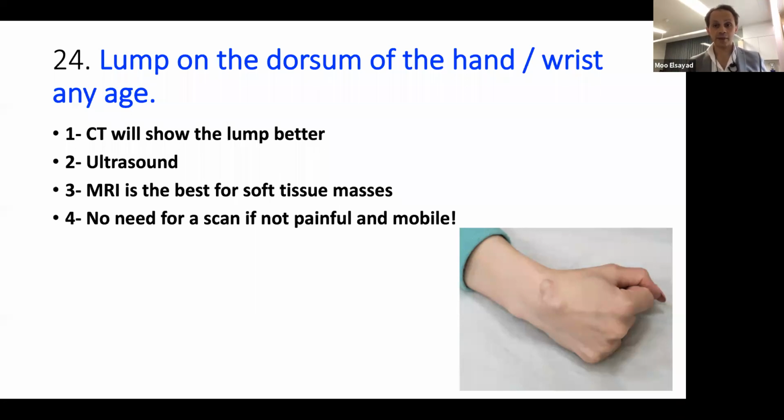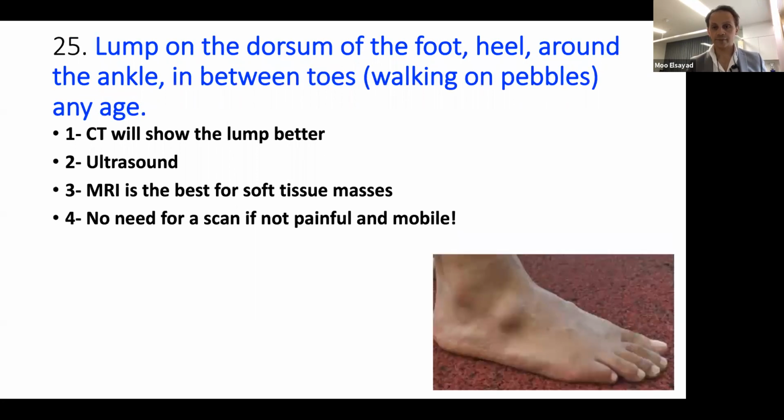So you may be helping the patient to say, ultrasound plus or minus aspiration. We do it at the same time, book him for the right slot or book her for the right slot, and then scan, aspirate, end of the story, it's finished. Of course, you need to have a discussion with the patient about aspiration and how it's done. Again, leg lump, heel lump, again.